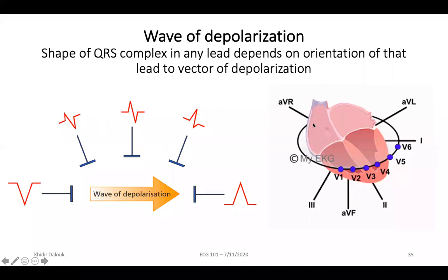You can see that usually the activation wavefront starts in the sinus node. You have to remember your anatomy. Where is the sinus node located? It's located in the junction between the SVC and the right atrial wall. And then the activation wavefront spreads to the atria, before it goes down. This is the base of the heart, and this is the apex of the heart, of course.